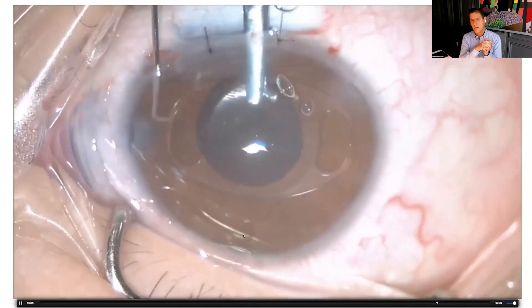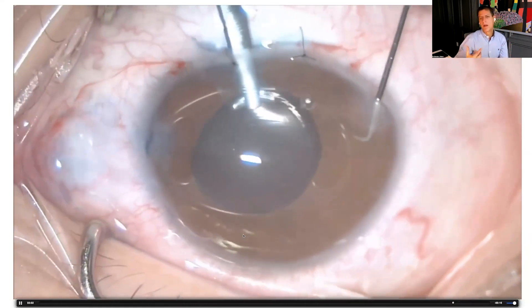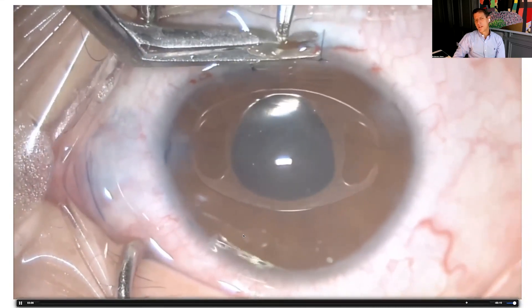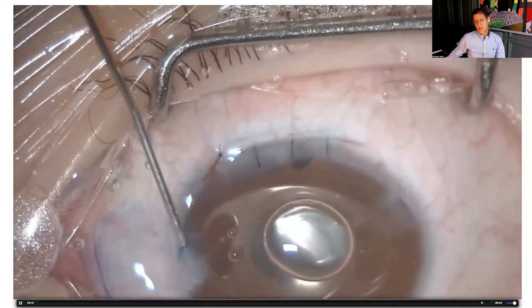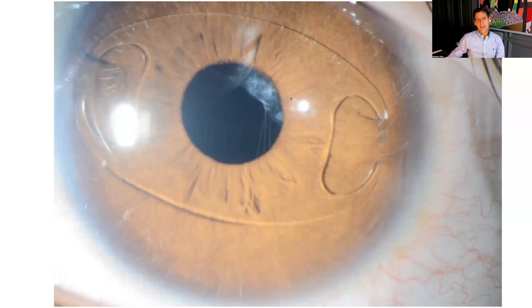Then we perform our paracenteses and fixate the Artisan lens. It's important to instill miotic drops to constrict the pupil, which makes centering easier. We fixate the lens, perform a peripheral iridectomy, and close the wound. Postoperatively, the capsule retracts, we have good fixation with about 1 mm of iris enclavation, and if the capsule doesn't retract we can do an early capsulotomy — preferable to performing a vitrectomy.